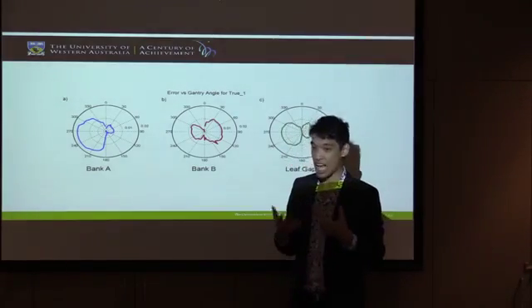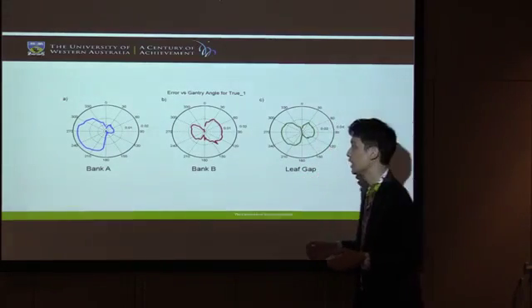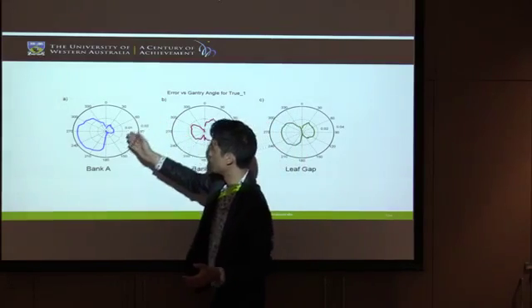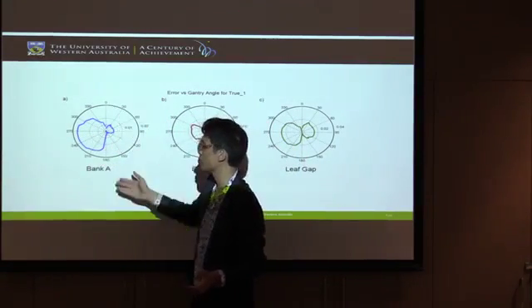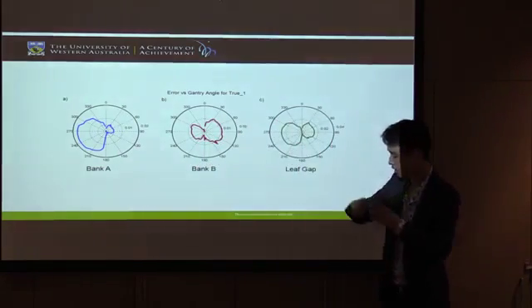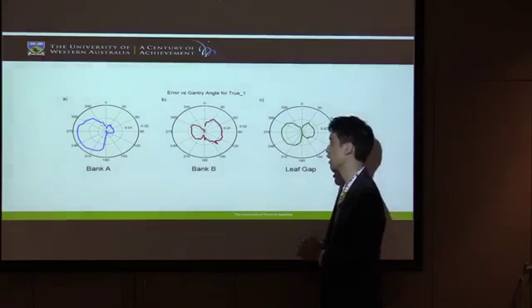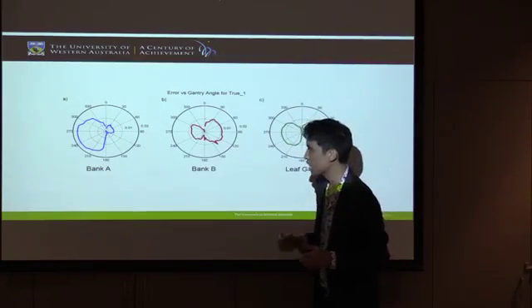So you definitely see that there is a gantry dependence on the error. It's there. There's a wide one at 270, less so at 90, well, at least compared to 0 and 180, and it's more even, symmetrical for bank B, which is weird.